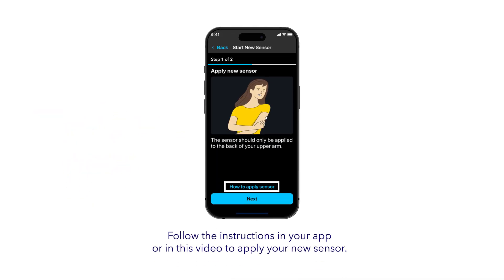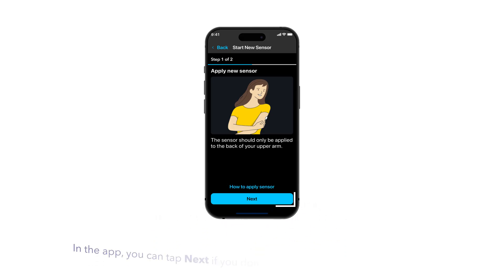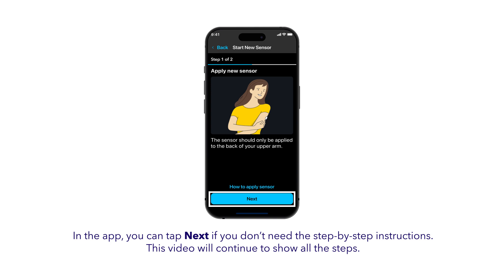Next, you'll apply the sensor. You can follow the how-to apply sensor steps in the app or in this video, or you can insert it on your own. In the app, you can tap Next if you don't need the step-by-step. This video will continue to show them.